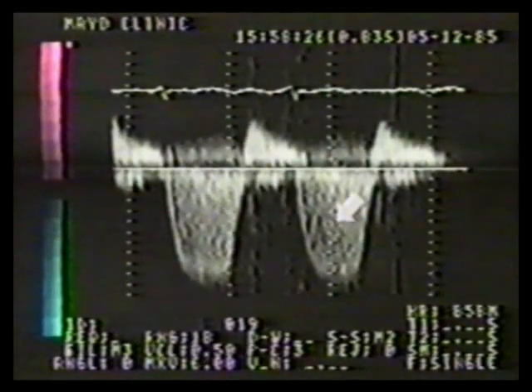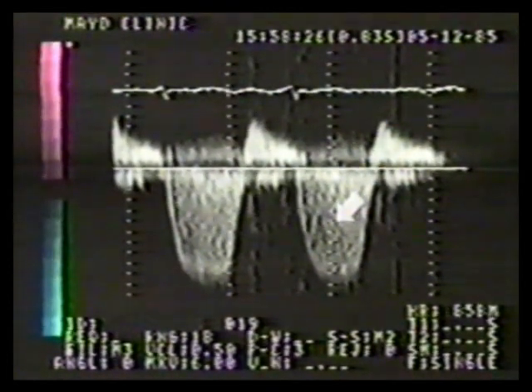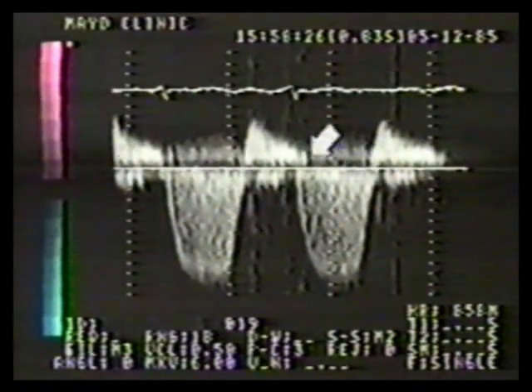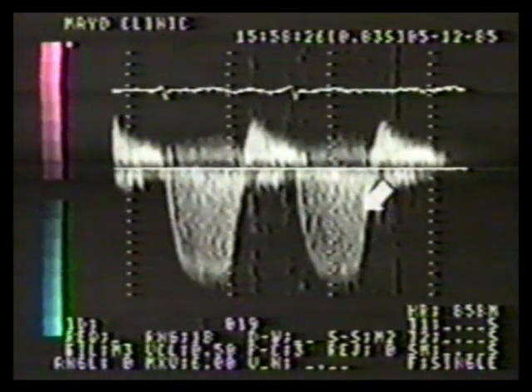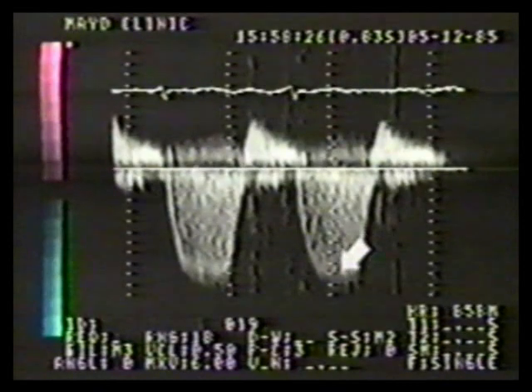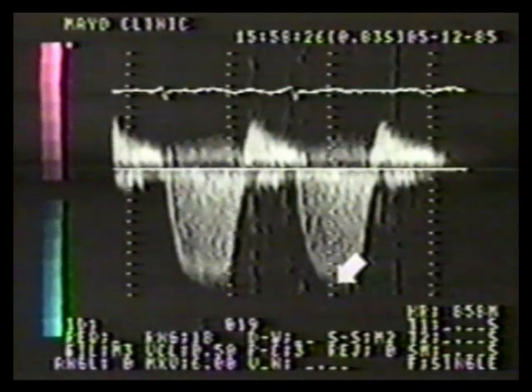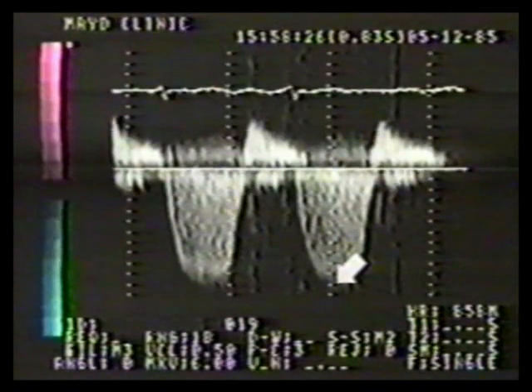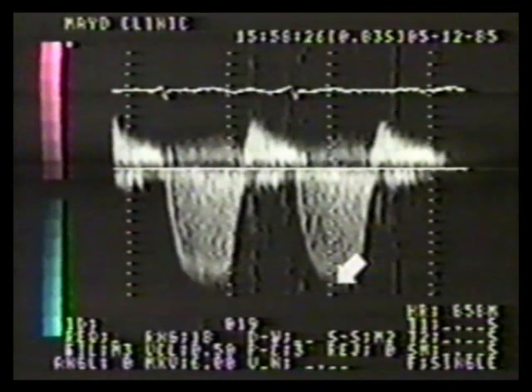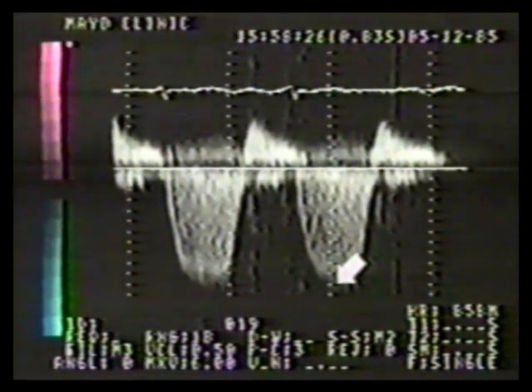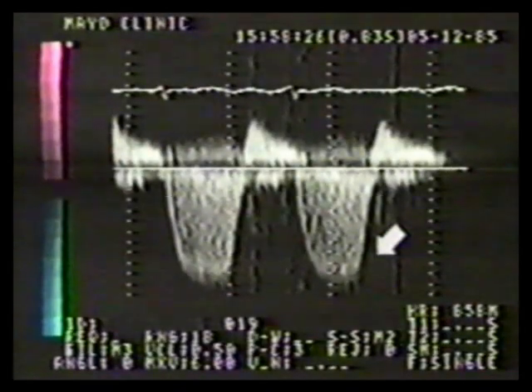The diagnosis of mitral regurgitation can be confirmed by continuous wave Doppler. These signals were obtained with a non-imaging probe at the apex. The patient also has mild mitral stenosis. This holosystolic envelope represents mitral regurgitation. Note that this is a high-velocity jet at 5.5 meters per second. In real time, listen to the characteristic audio signal of mitral regurgitation.